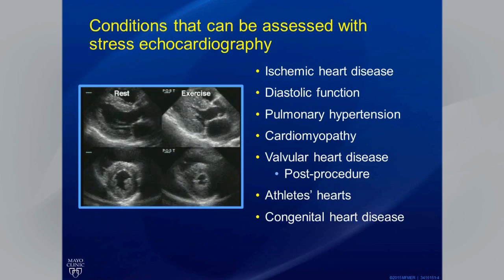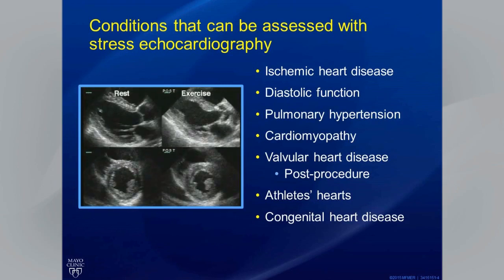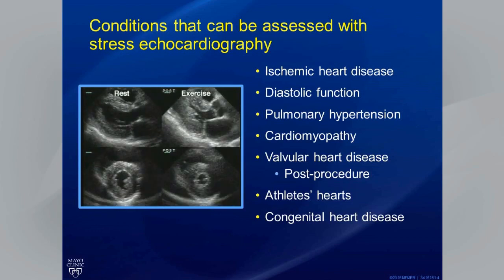However, stress echocardiography can also be applied to assessment of diastolic function, pulmonary hypertension, cardiomyopathy, valvular heart disease, including patients who have had valvular procedures, athletes' hearts, and congenital heart disease. The amount of evidence for stress echocardiography in assessing these different conditions does vary somewhat. However, stress echocardiography can be helpful in some very challenging clinical circumstances, as we will see.